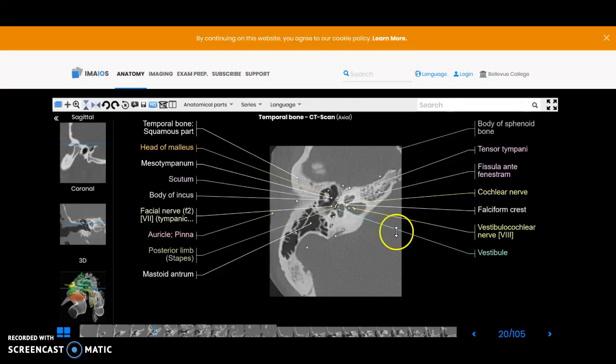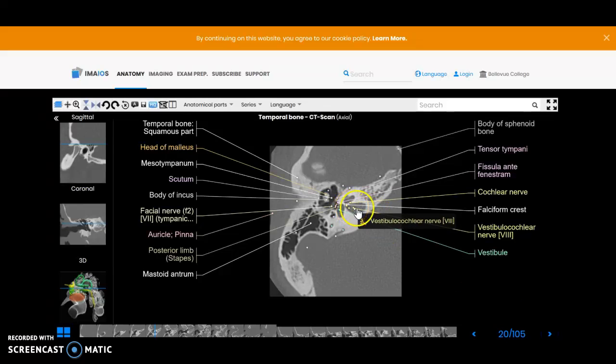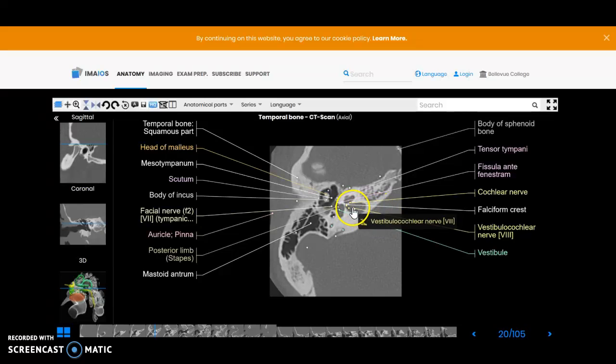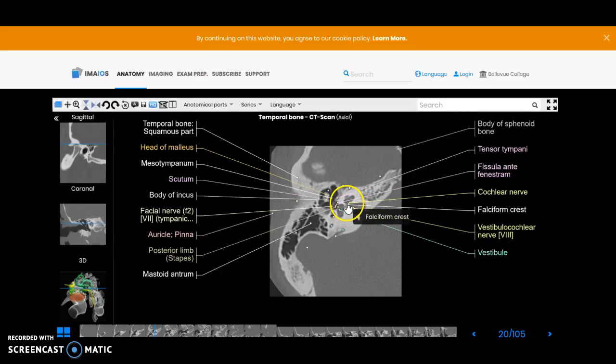And there you're catching the IAC, so it wasn't as great a picture as you sometimes see where you can see it come all the way in in one slice. But you are catching the seventh and eighth nerves here and then the cochlea sits anterior to that.